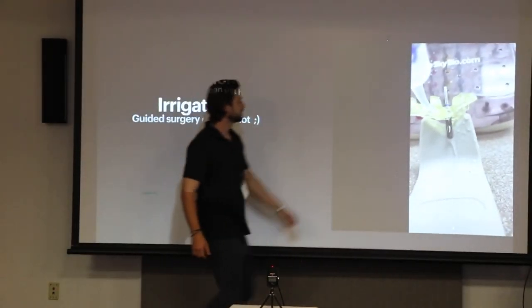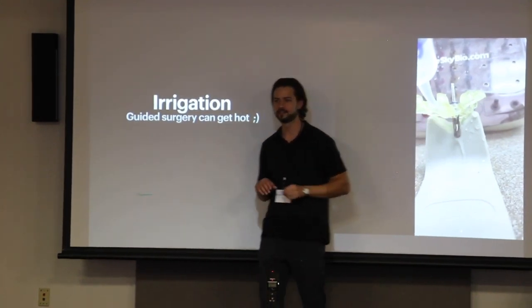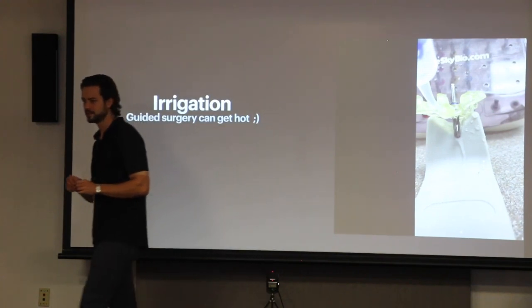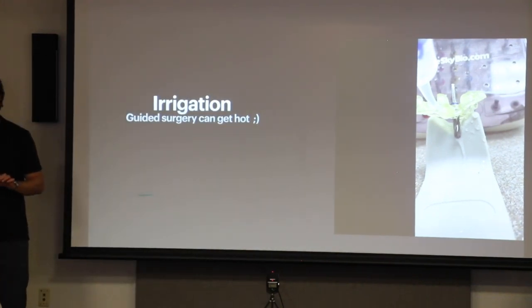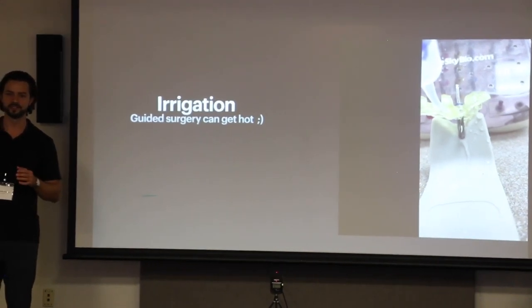I designed this little window here. Inside Blue Sky Bio there's an area to add pins. Pins are these small retentive — well, pins, I guess it's in the name — they go in the bone, and if you have distal extensions that you have a little bit of play in, they kind of support that.